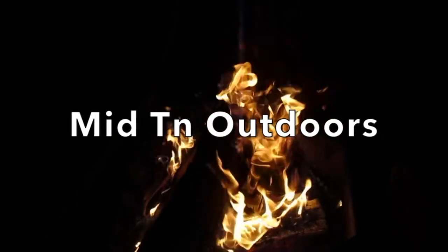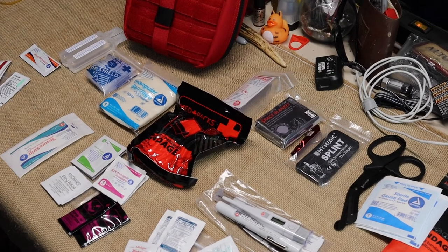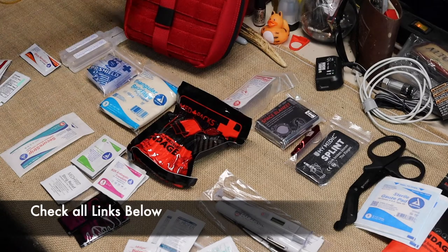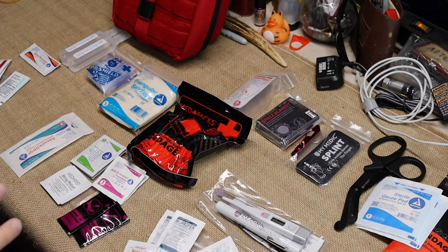What's going on everybody, welcome back. I'm going to show you what all is in this kit that's now on the workbench. We're going to take a look at everything, kind of reassemble it, and talk a little more about the packs they have.